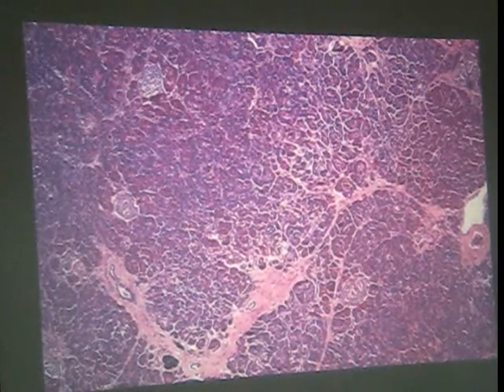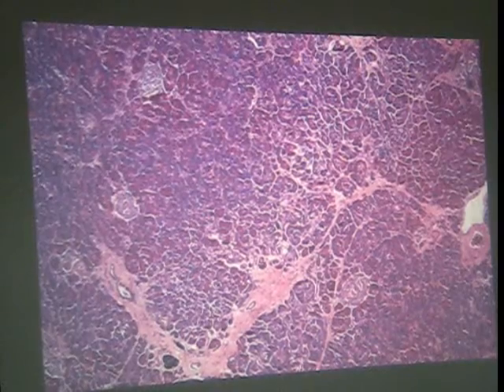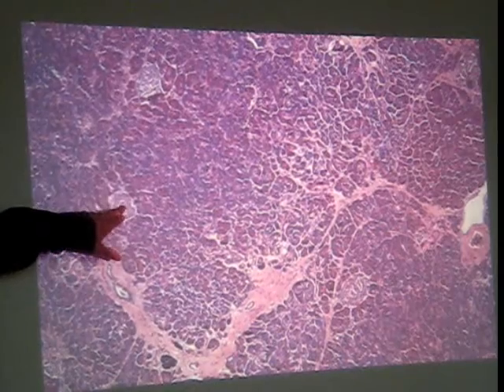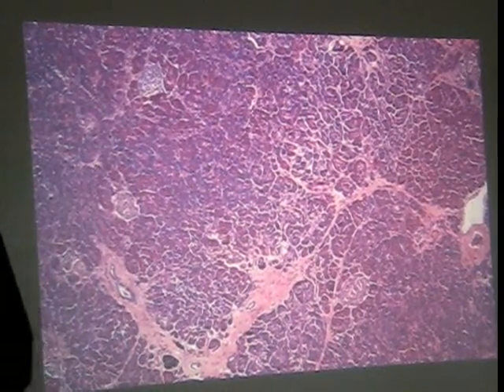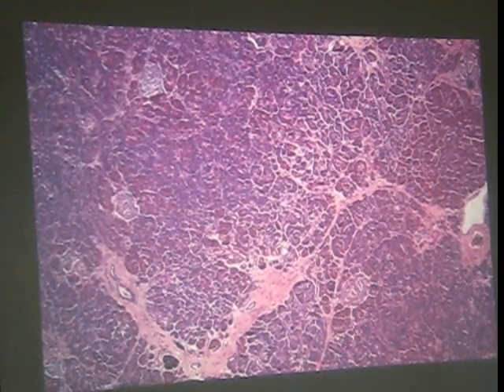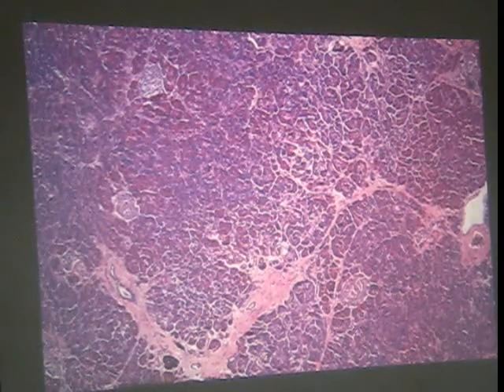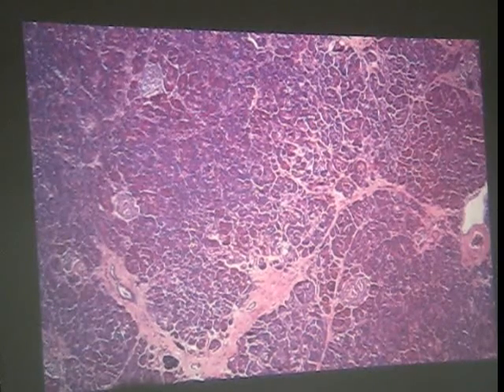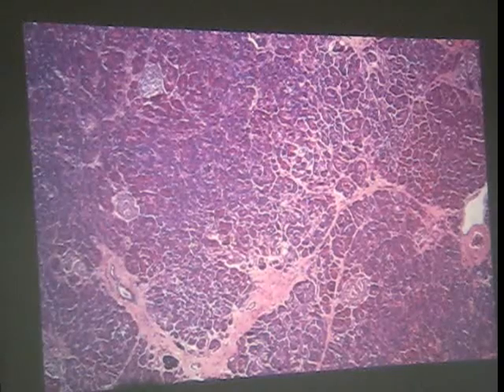All right, what are we looking at here? Yeah, this is another slide that will be on the exam. And how do we know it's pancreas? Exactly. And here, should we assume that we're always going to get a good stain? Because sometimes the stains are really pale, and it's hard to see that there's lighter sections. We will do our best to provide material that's reasonable. I mean, it doesn't do my ego any good to screw you guys that way.